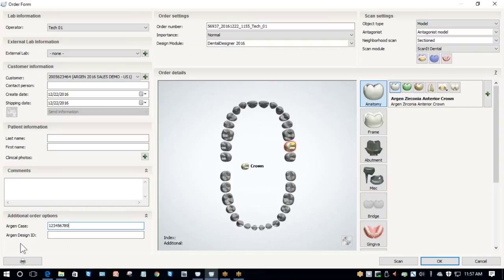After that, I need to fill out Argon Design ID. Specifically, I need to fill this out because I'm uploading this case to Argon for design services. So I just need to come up with a unique ID number here. Now that I've done that, I need to check my scan settings.